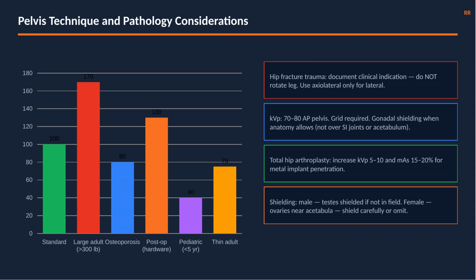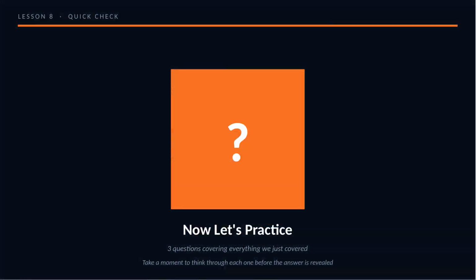When in doubt on any pelvic exam, consult the radiologist before shielding. 3 hip and pelvis questions.